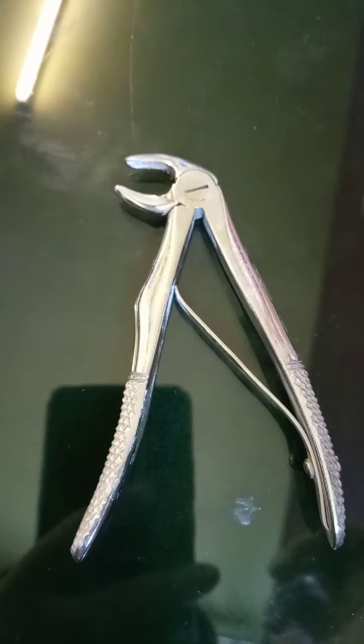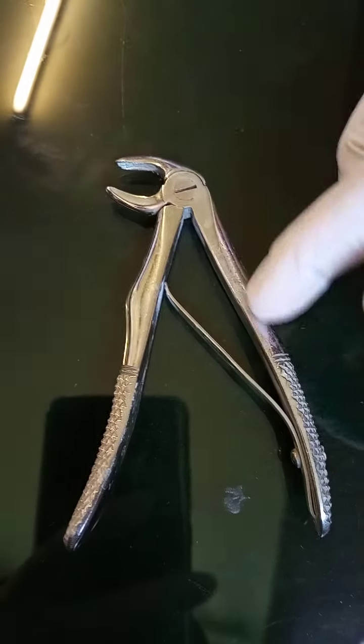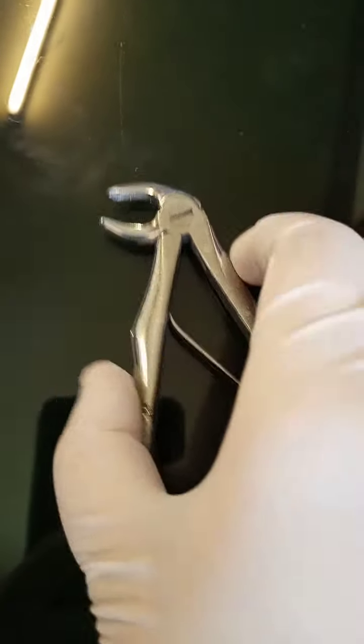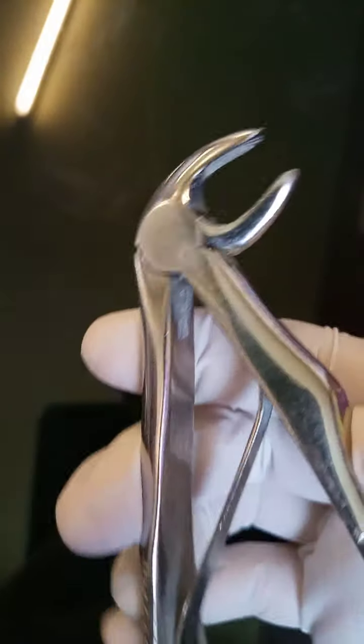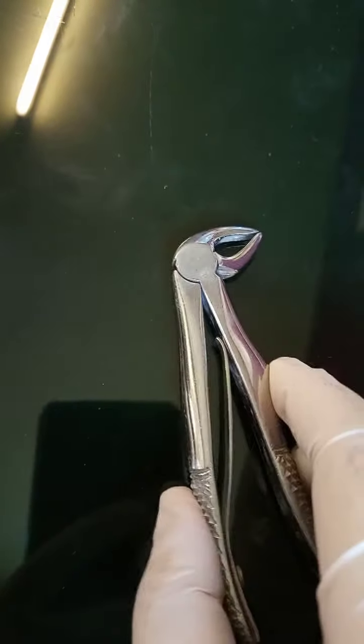This is lower anterior extraction forceps. It has beaks, hinge, the handle and the dental spring portion. The beaks are usually concave and serrated from the inside in order to have a strong grip around the tooth.